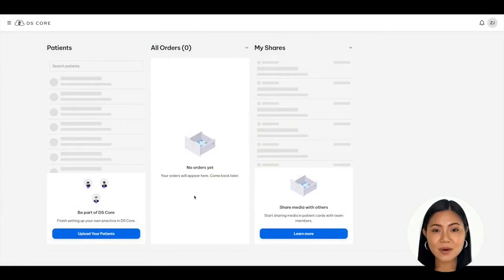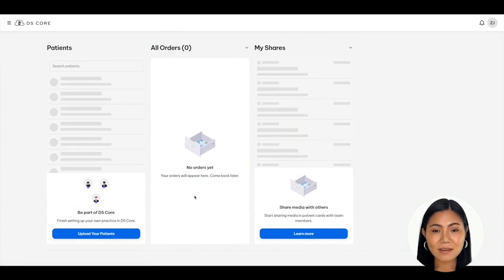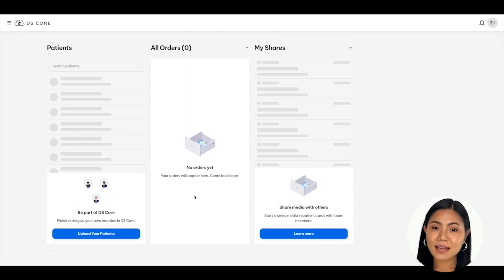First things first, if you are not logged into your DSCore account, go to dscore.com and sign in with your email address and password. If you are brand new to DSCore and need to create an account, pause this training and go to our how-to sign up for a DSCore practice account video and start there first.